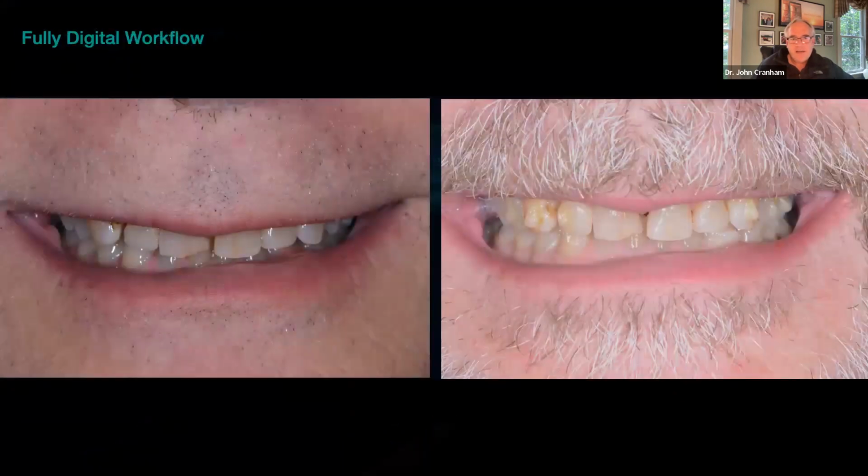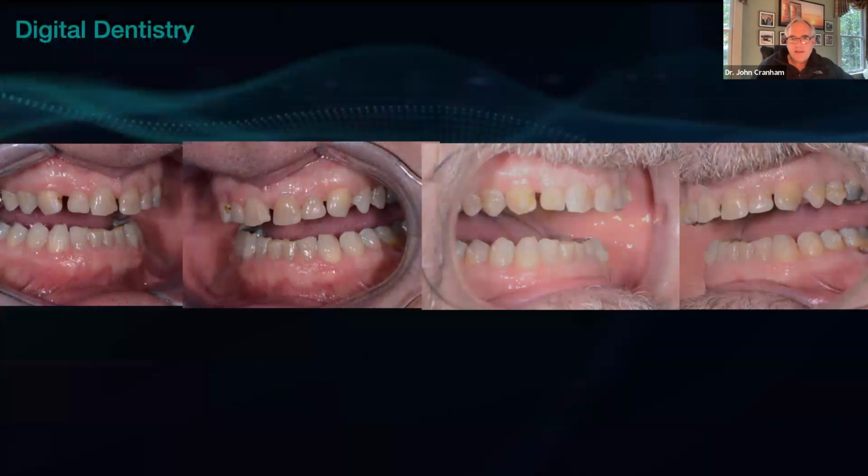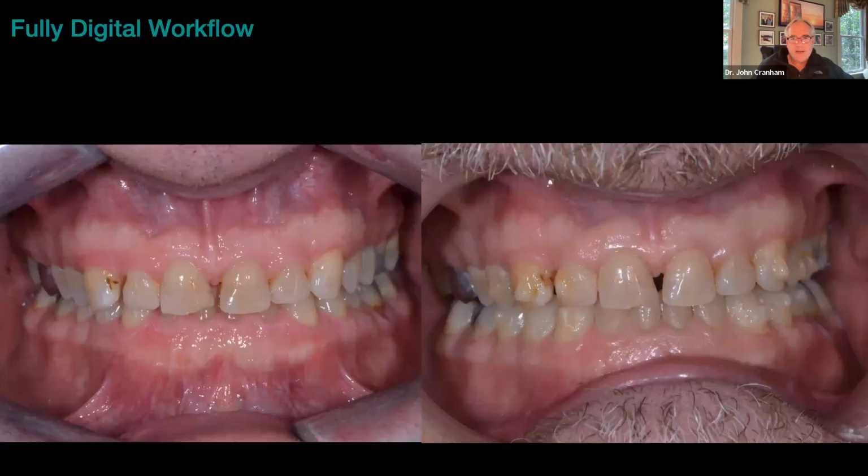There's his pre-op Invisalign, or pre-op picture. There he is. Actually, there's pre-op, there's post-Invisalign. There you go, pre-op, post-Invisalign. You can see how you're seeing a little bit more of the bottom teeth. Things are a little bit straighter, but I'm going to be restoring these edges, don't forget. But this is the biggest thing. There's the overbite here. This is the pre-op, and we did it by a little bit of extrusion in the back as well as intrusion in the front.